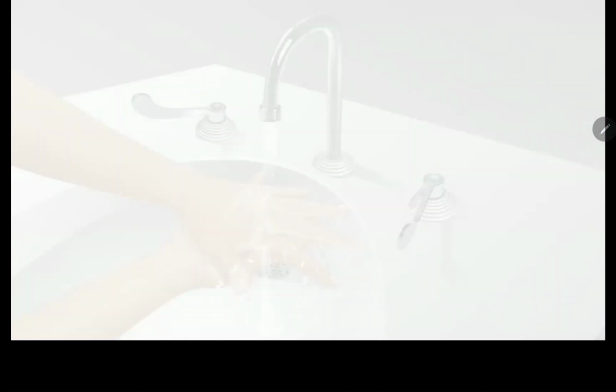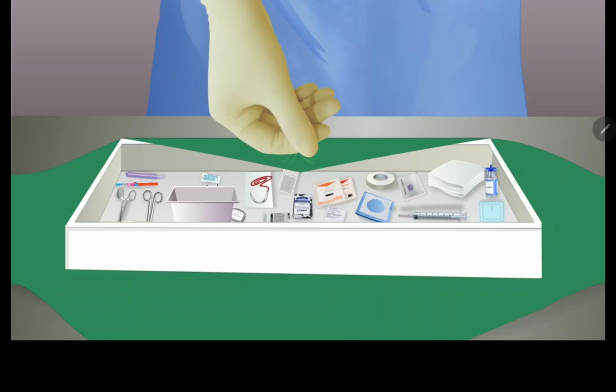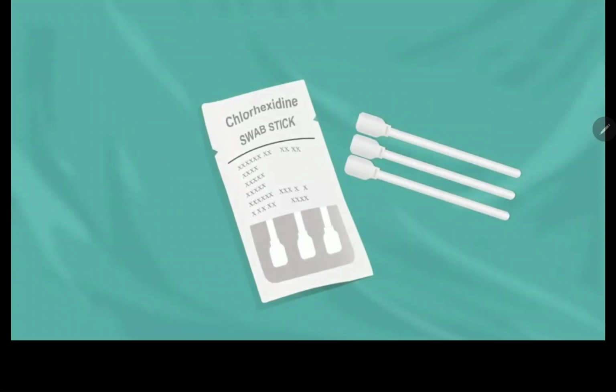Perform hand hygiene and don gloves. Comply with universal protocol. Assist the practitioner as directed with preparing the sterile field. Open the chest tube insertion tray and appropriate supplies as directed, using aseptic technique.